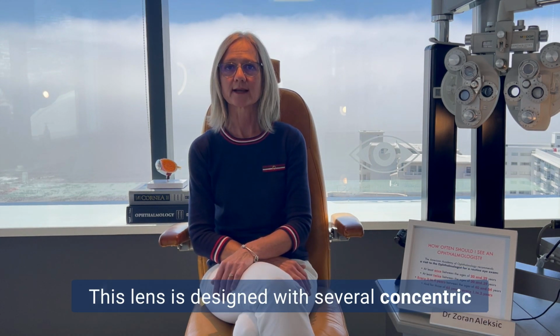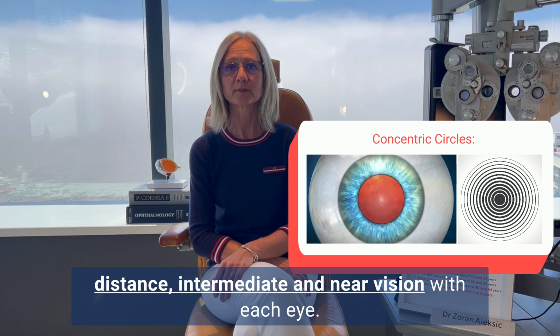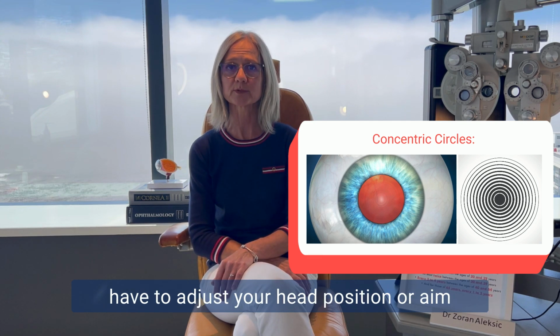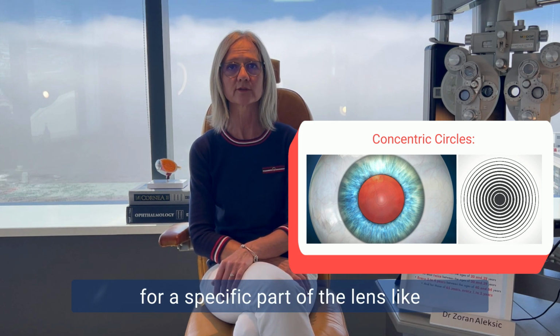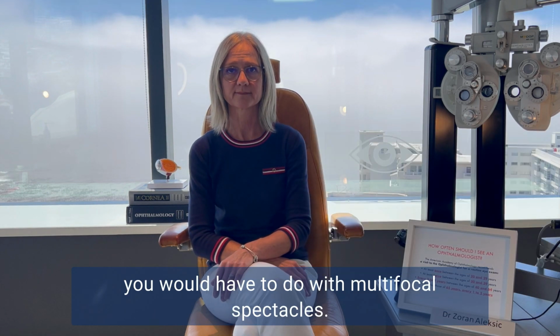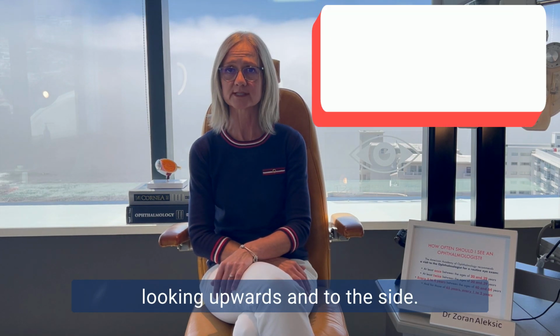This lens is designed with several concentric circles, providing multiple focal points, thus allowing for distance, intermediate, and near vision with each eye. Because of the circular design, you don't have to adjust your head position or aim through a specific part of the lens like you would have to do with multifocal spectacles. One can read in any position, including looking upwards and to the sides.